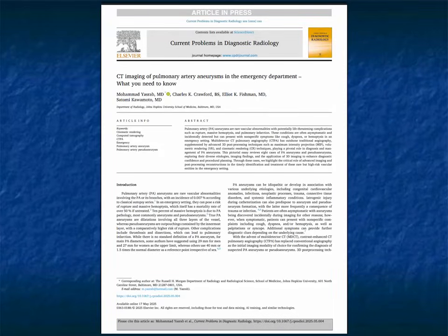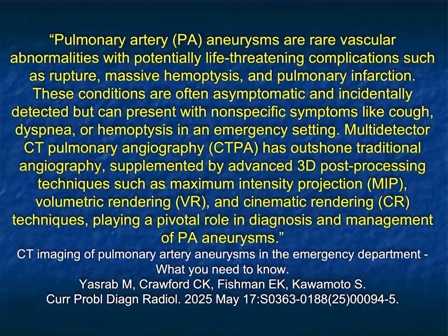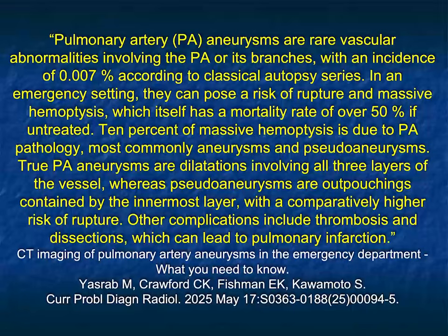Now, we published an article. This is actually still in press. Yasrub did a great job, CT imaging of pulmonary artery aneurysms in the emergency department, what you need to know. And we looked at many things. They're rare vascular abnormalities, as I mentioned before. And we also talked about the importance of post-processing, including volume rendering and cinematic rendering, as a way of being able to detect and define these aneurysms and pseudoaneurysms.